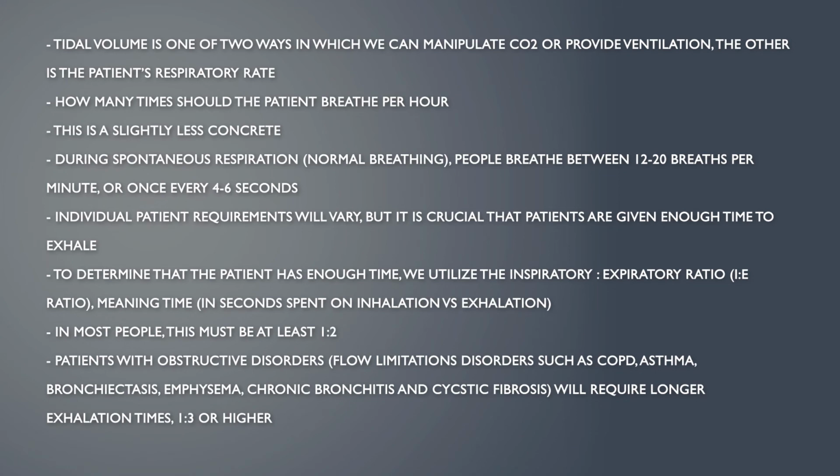So in those patients, if you see your patient not fully exhaling, and you're going to be able to see that not only in your patient's chest, but more importantly in the ventilator graphic, we want to see each breath returning to baseline. And we want to get that patient closer to a 1 to 3, possibly higher IE ratio. So you're going to see that on your machine.